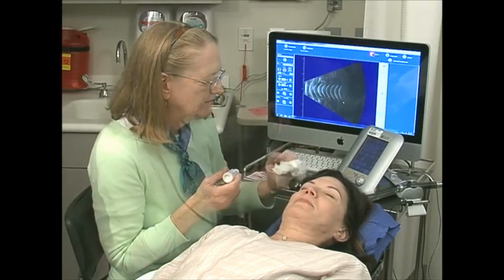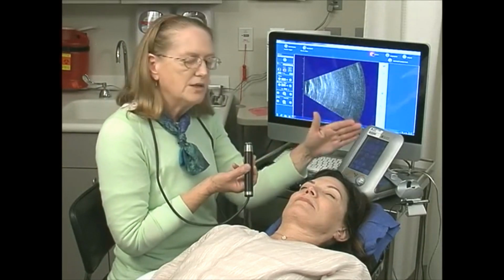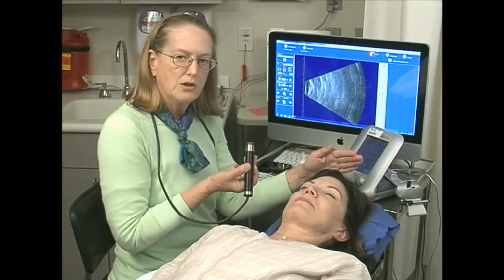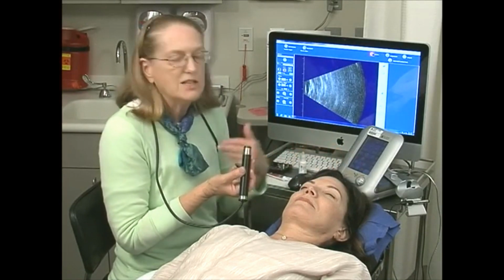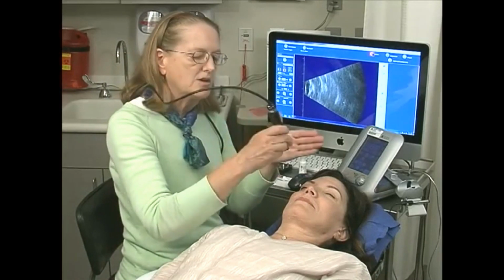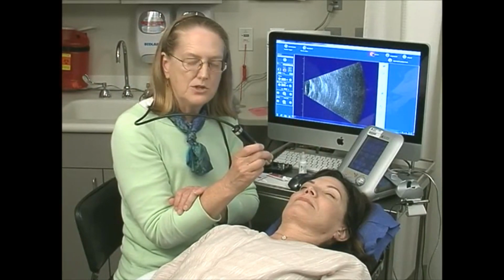No. Okay. And we'll start initially of our 4-quadrant exam with the patient looking superiorly, and the farther away the patient can look from where I place my probe, the more anterior periphery I can get with the sound. And that's what we need to see. So I start initially every single one of my transverse scans, either horizontal or vertical. We start by localizing the optic nerve.